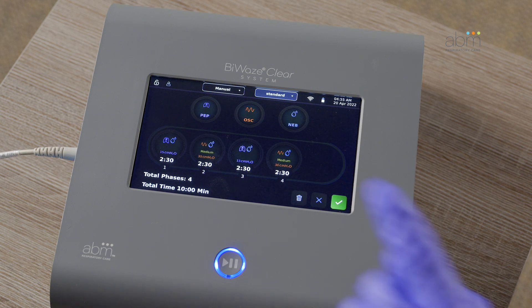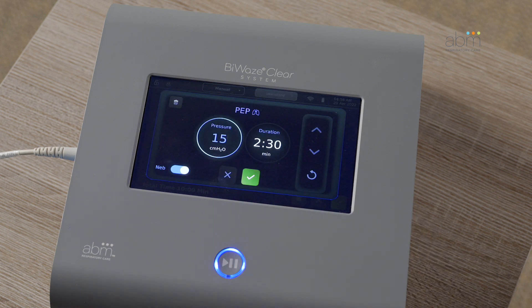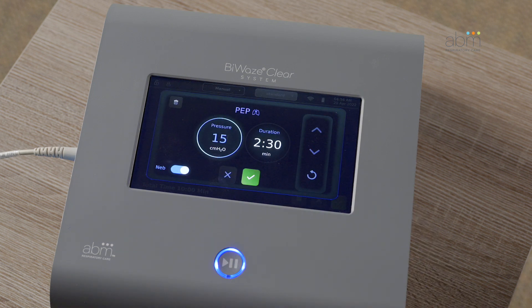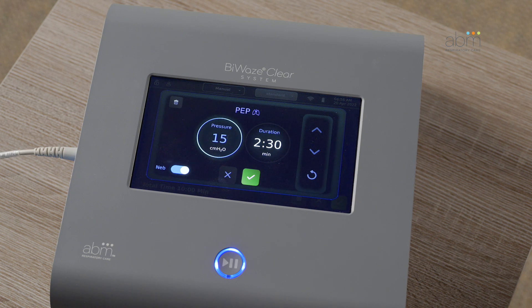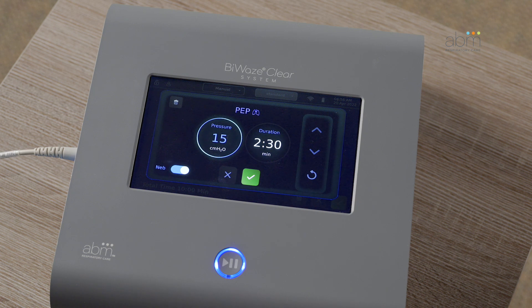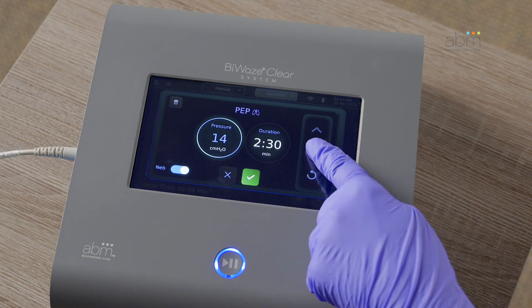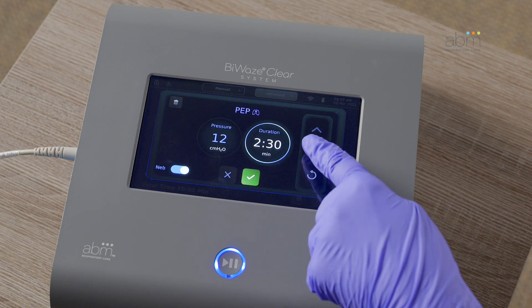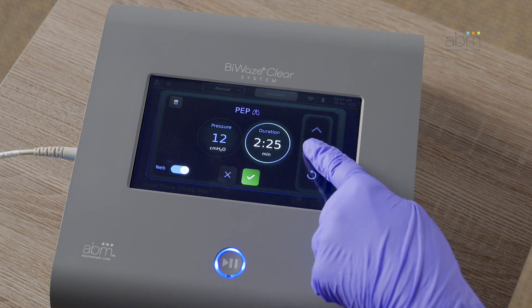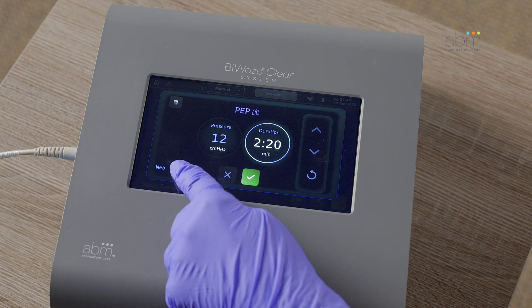Press on the phase to edit the settings or to remove the phase. To edit the PEP phase, use the arrow keys to adjust the pressure and time. The pressure ranges from 0 to 30 cm of water, and the time can be set from 5 seconds to 30 minutes.